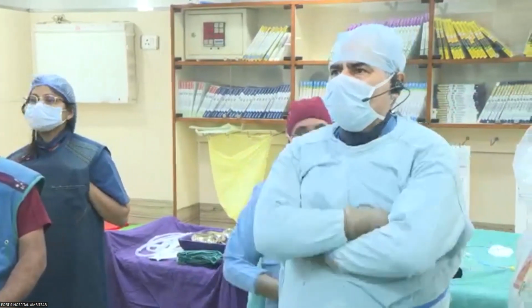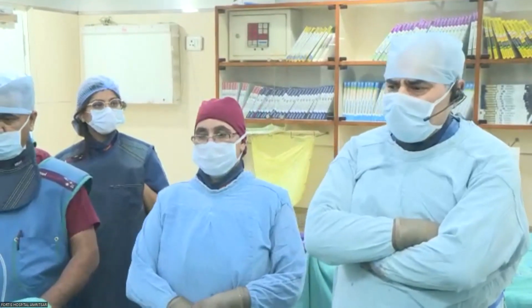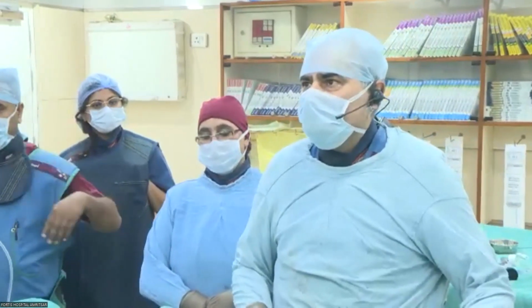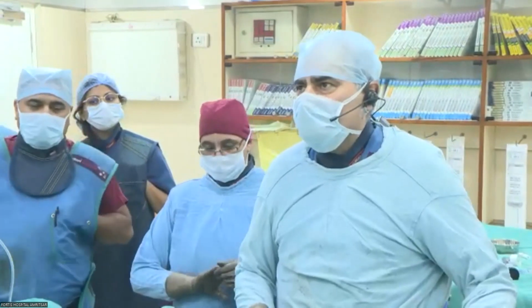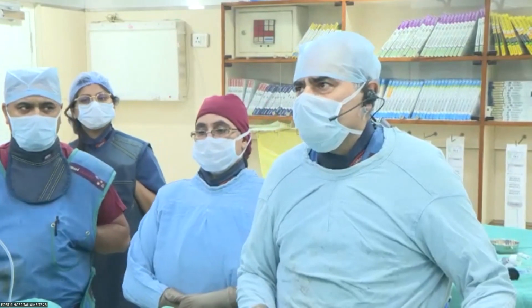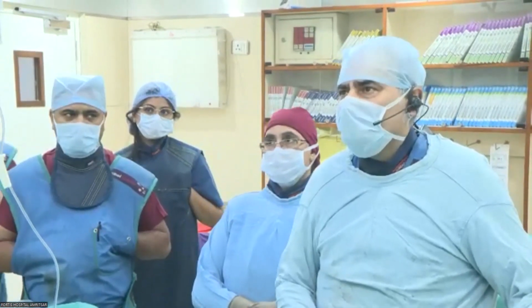Arun, one point I just wanted to emphasize here. If you use a cutting balloon into the circumflex where you have a tough angulation, take a 6 millimeter, not a 10 millimeter. 6 millimeter cutting balloon definitely will cross easier than a 10 millimeter. People try to take a 10 millimeter. That is one reason that your cutting balloon may not cross.